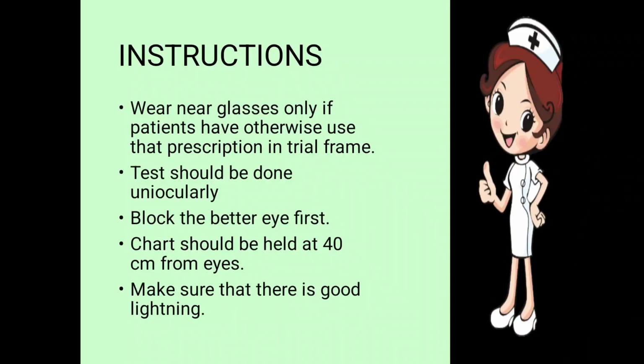Block the better eye first. That eye which is better, we will block it.